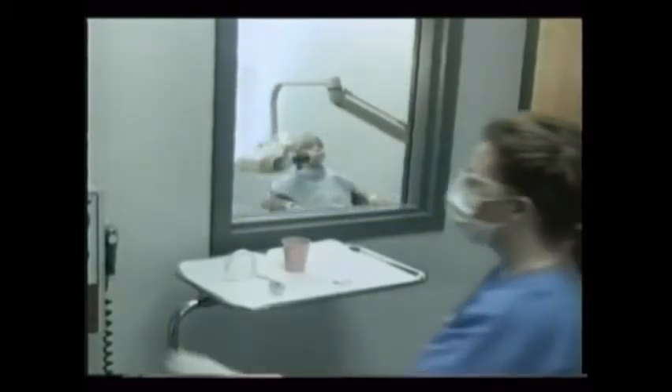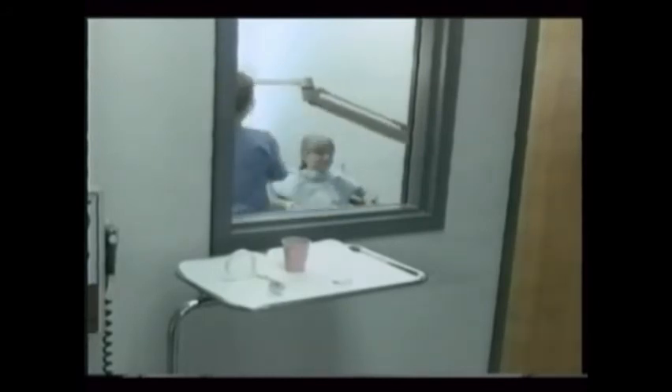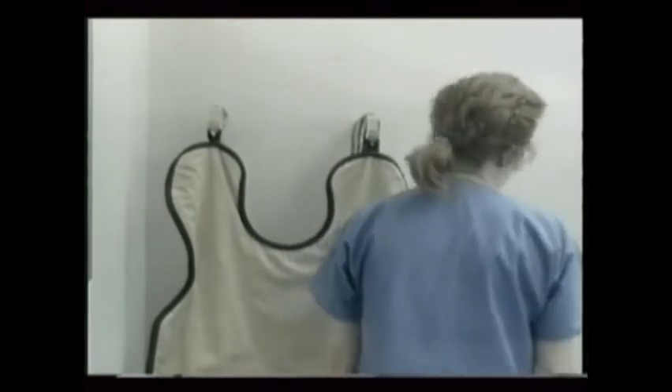Only practice develops your x-ray skills. By using proper techniques and film-holding devices, you'll minimize retakes and exposing the patient to excessive radiation. Be sure to hang the apron when finished — never fold it. This keeps the lead from breaking within.